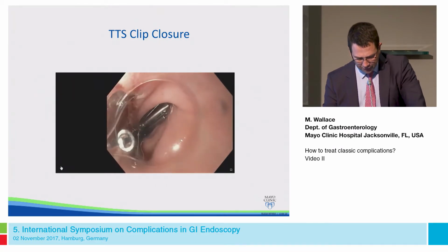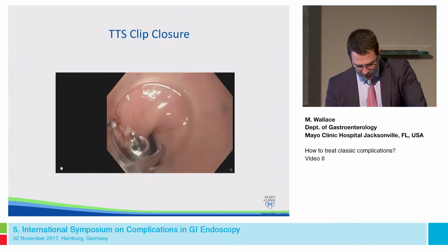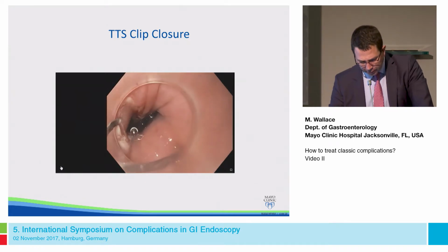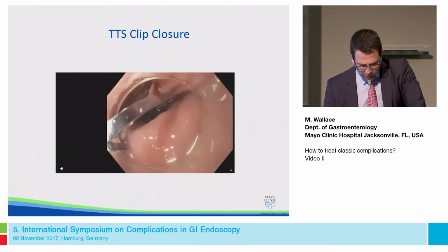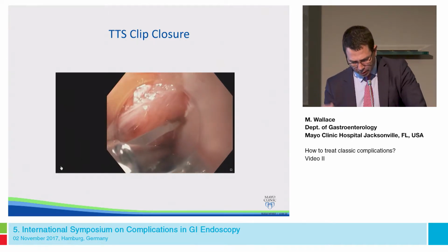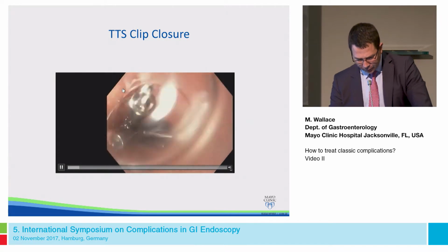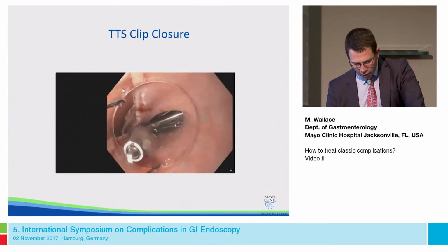We stack these on top of each other, and you can see that it's challenging because this is a very wide defect. Trying to grasp and close that defect was technically very challenging to do. It eventually required 13 clips in this defect that was approximately 1.5 to 2 centimeters. So the principle here is to start outside the defect, to slowly pinch it together like a zipper. You can see the layers here, the submucosal layer, and then the muscle layer here, and the pericardium still beating there. But we're stacking the clips very close together so that we get a secure closure.